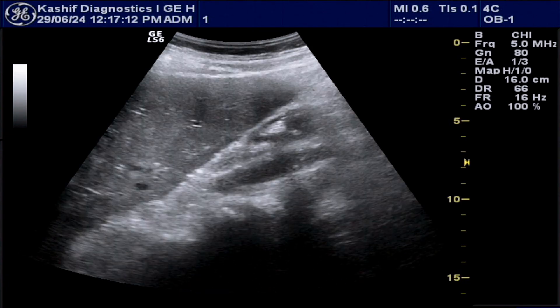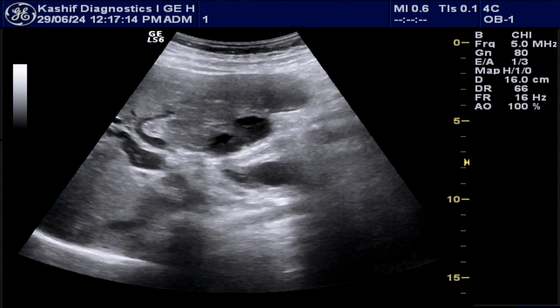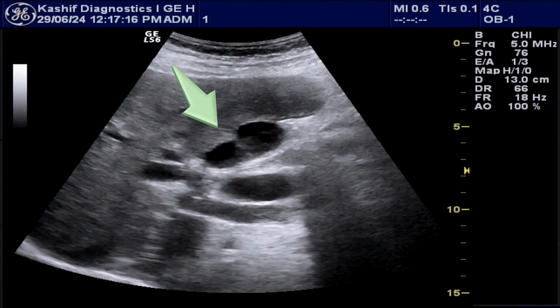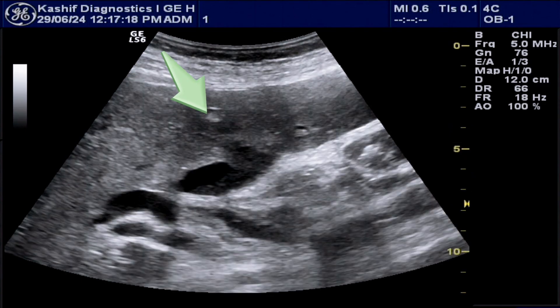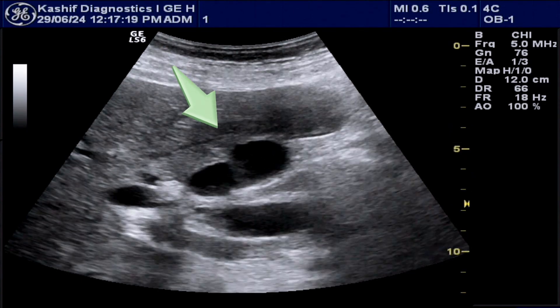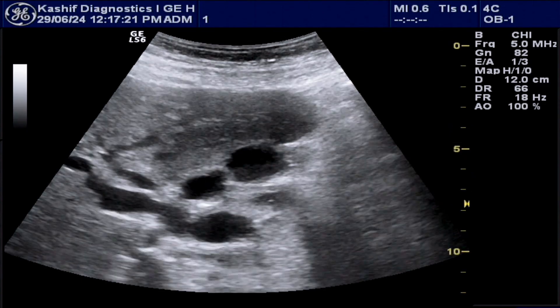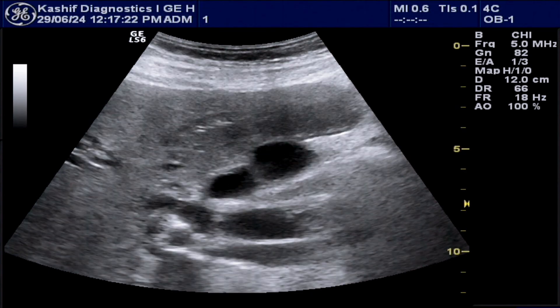This is the gallbladder. It is partially contracted and small in size. No calculus is seen in the gallbladder; however, layering sludge and debris is seen, which may be due to chronic infections.